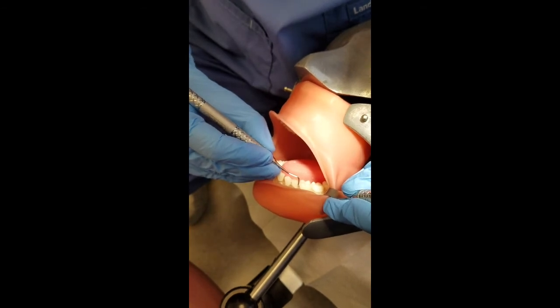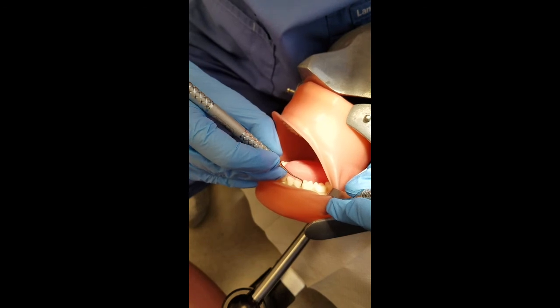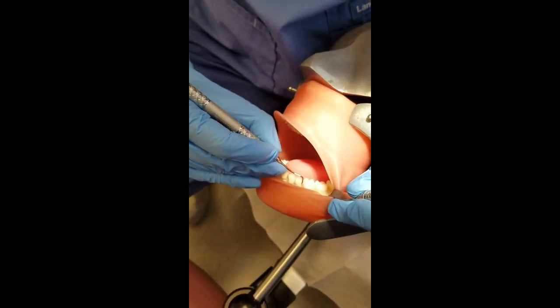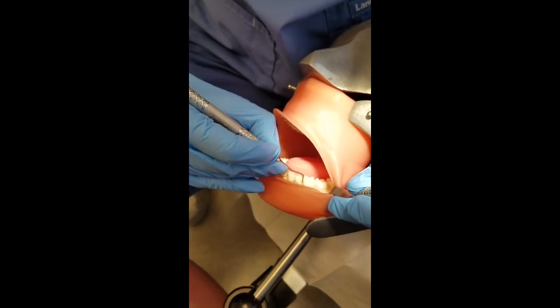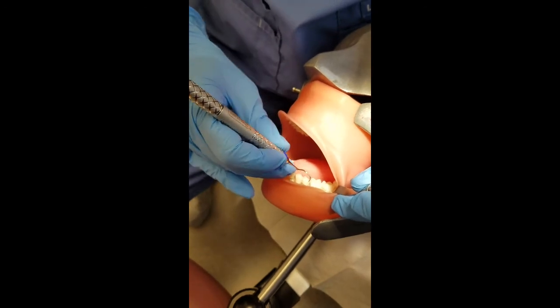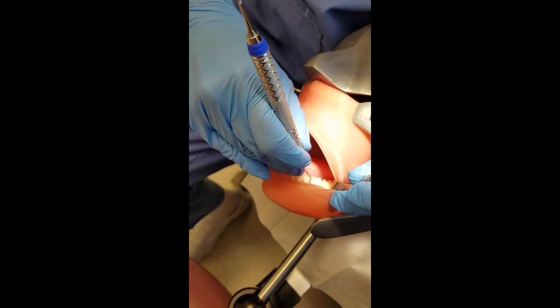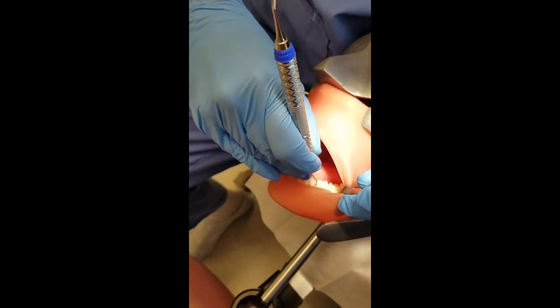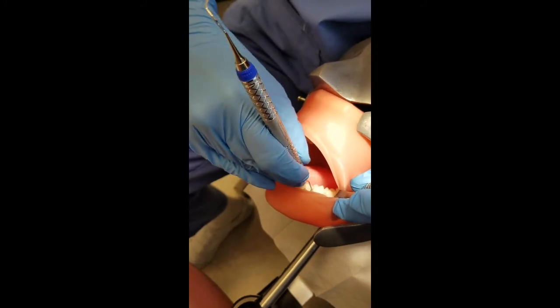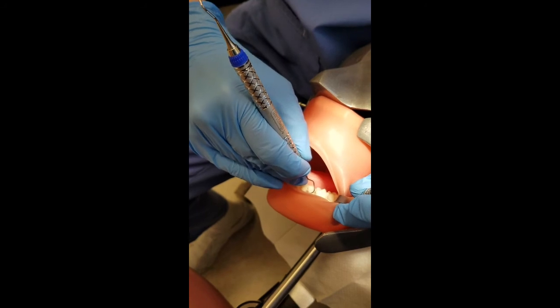At the height of your stroke, that is where you're going to adapt your instrument, and you're going to continue doing these strokes until under the contact area. Once you are at the contact area, you're going to back out the tip and adjust towards the tooth to face in the mesial direction. Start 1 stroke before the distal line angle and do a distal rock to explore and a mesial rock to scale. These are going to be your oblique strokes. You're going to maintain your adaptation at the height of each stroke.